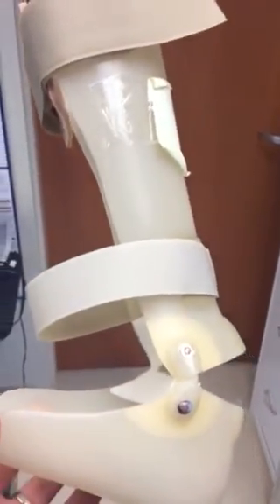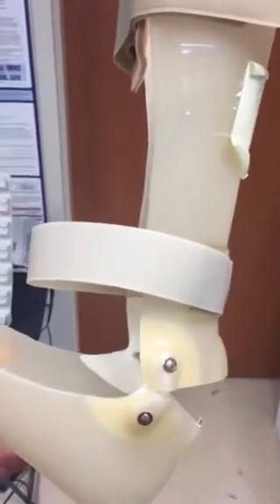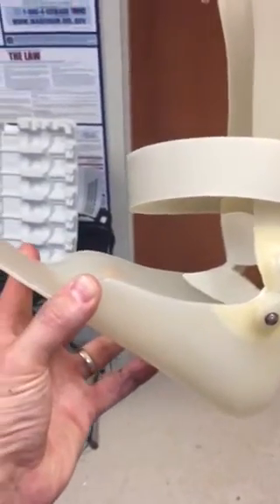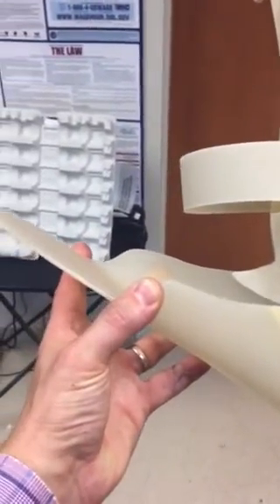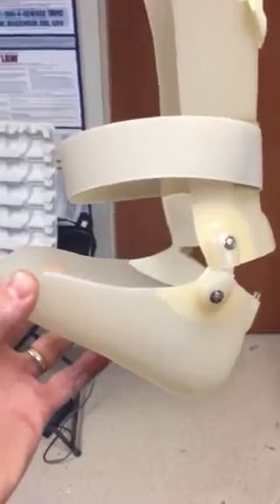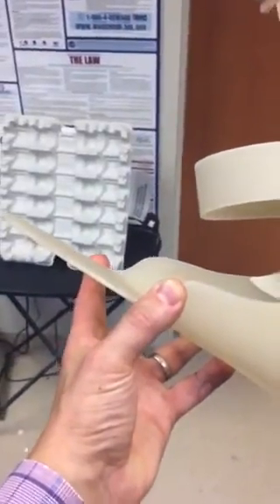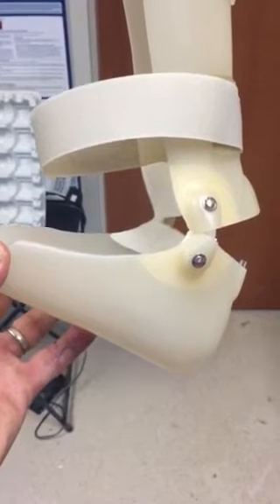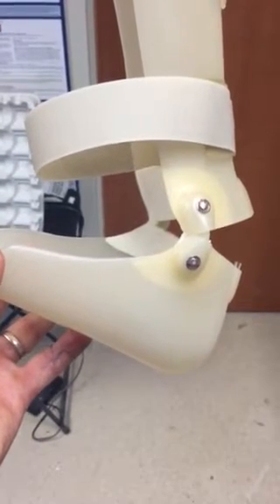But as you can see, at the same time, if we tip this up like this, the foot is actually kicked up into the air. Now the weight of the foot itself will weigh this down a little bit, so people won't walk with that angle of dorsiflexion assist, but there will be some help in that direction.